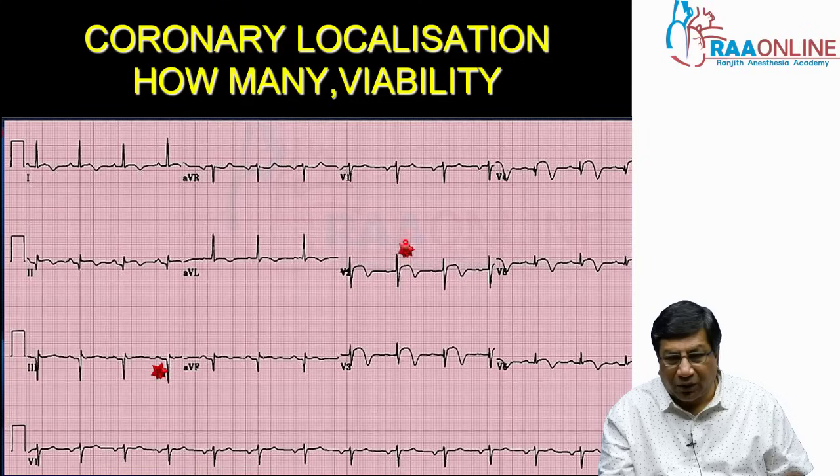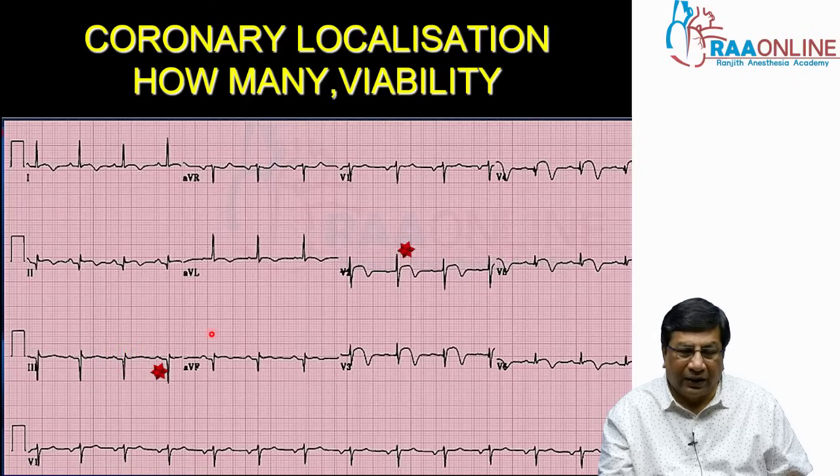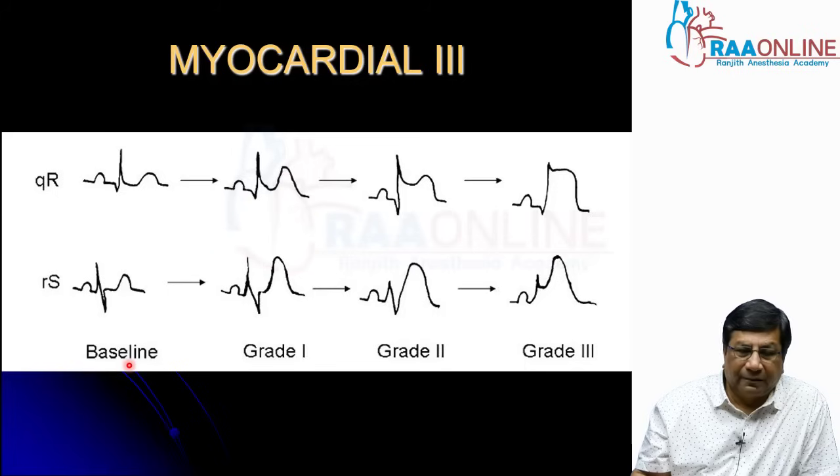If the obstructed coronary artery supplies healthy myocardium, shown by the presence of an R wave, it is very good for the patient to revascularize this area because you are going to save the healthy myocardium from permanent necrosis. Whereas when the patient already has a fully established scar, opening the artery to that scar may or may not yield benefit. Most often, it may not yield any benefit.